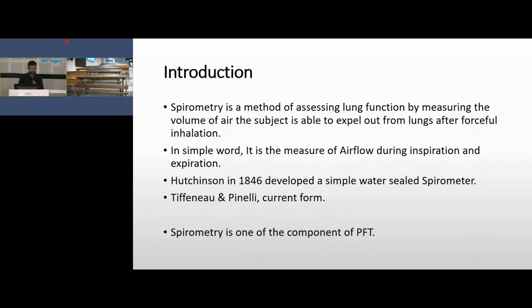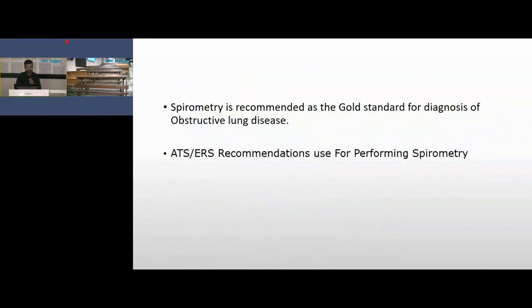Hutchinson was the first person, in 1846, who developed a simple water-sealed spirometer, and the current form is based on Tiffeneau and Pinelli. Spirometry is one of the components of pulmonary function tests, which also include DLCO, cardiopulmonary exercise test, and ABG. Spirometry is recommended as the gold standard for diagnosis of obstructive lung disease, and currently it is based on the ATS/ERS recommendations for performing spirometry.